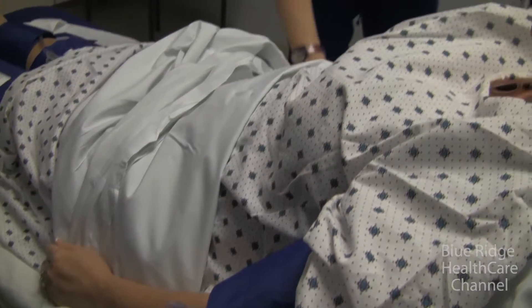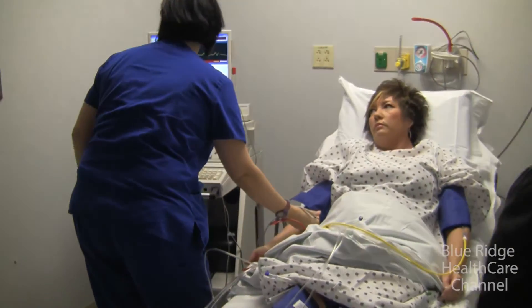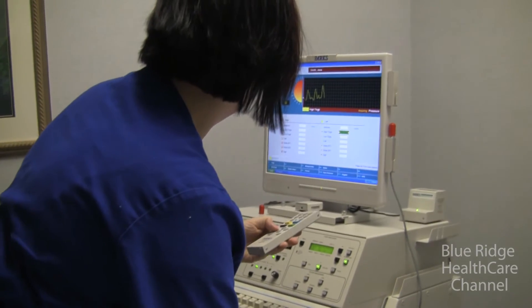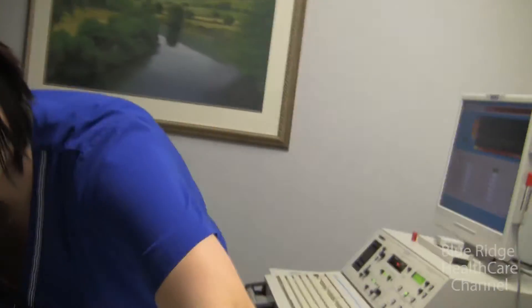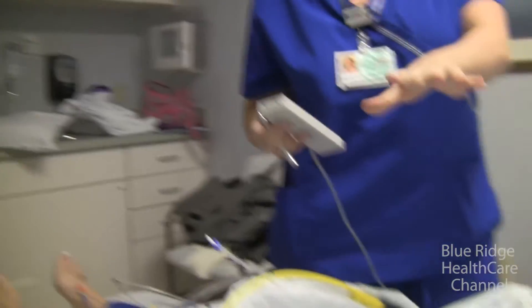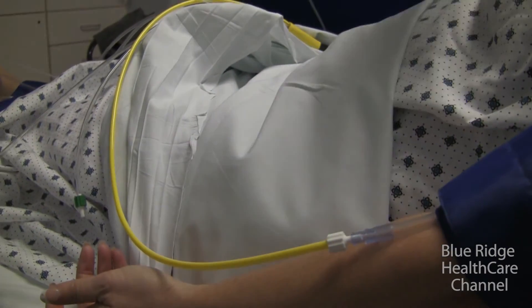So a little bit of gel — it's a little cold. You also compare arm to arm, because if one arm is about 20 points lower than the other, we know there's some kind of disease going on on that side.